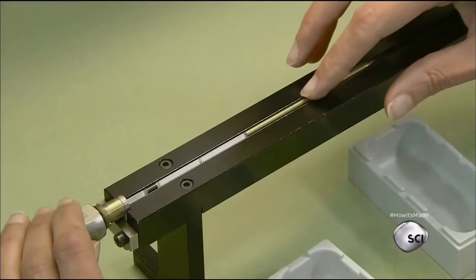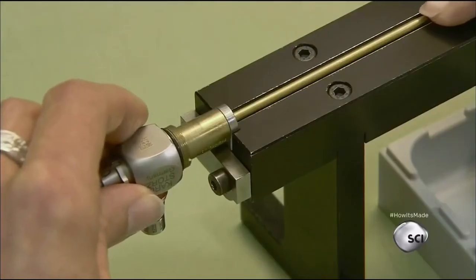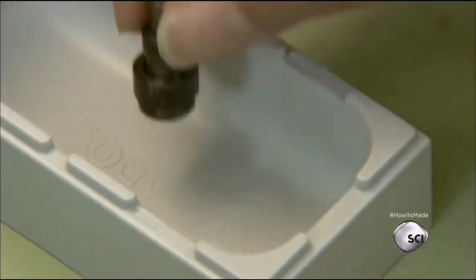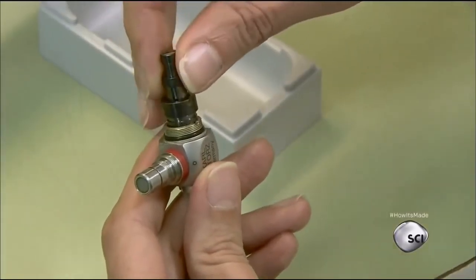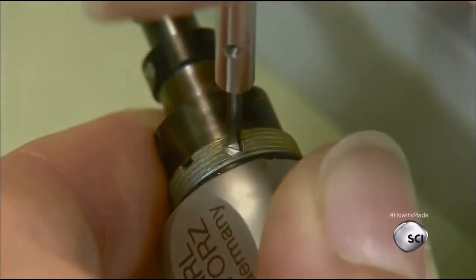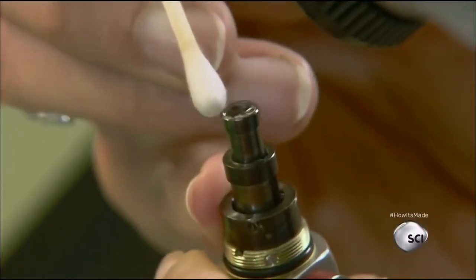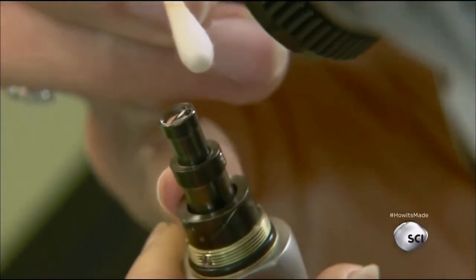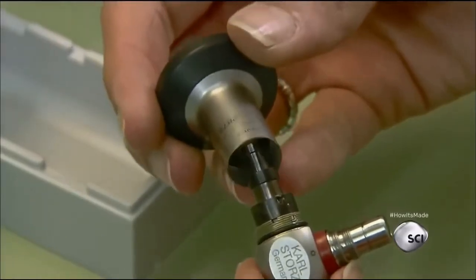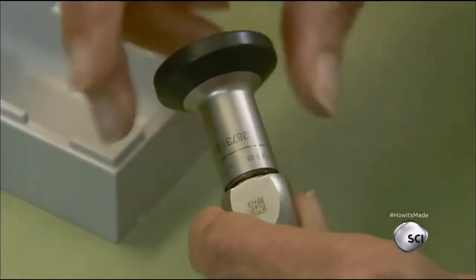Once workers have assembled the image transmission system, they gently slide it off the fixture into the inner sheath of the endoscope. Then they screw on an ocular cap to hold it all in place. A worker cleans the cap's glass top, then attaches an eyepiece. This gives the surgeon the option of either looking directly into the endoscope or looking at an operating room video monitor, which receives the image via a small camera attached to the eyepiece.